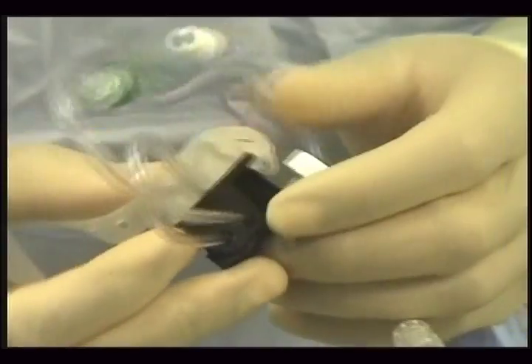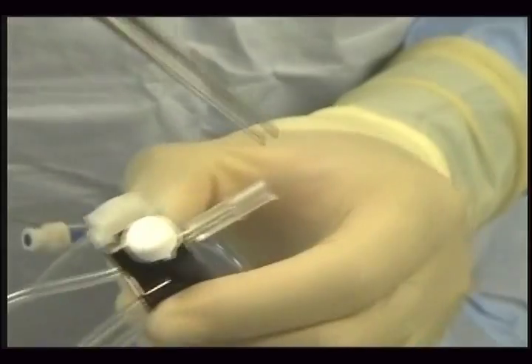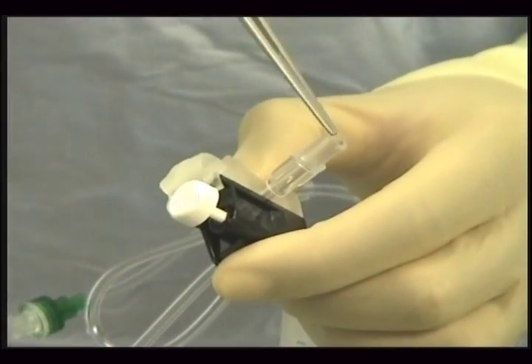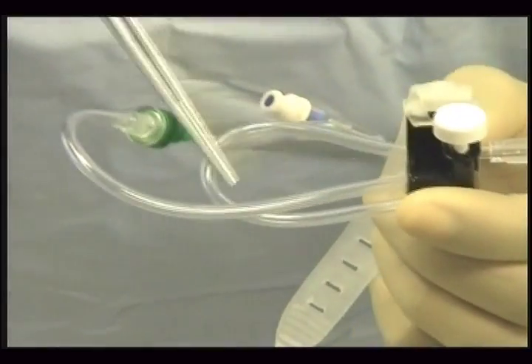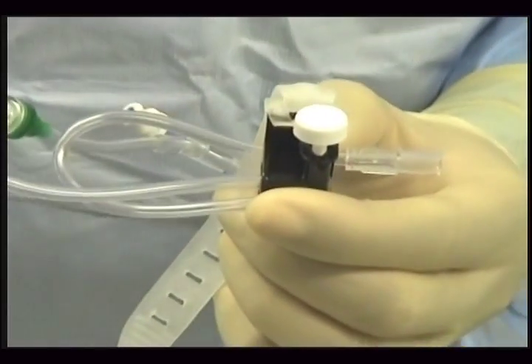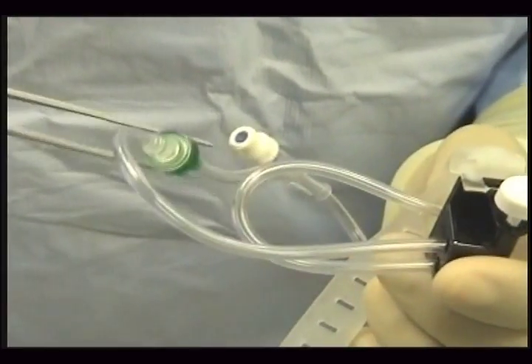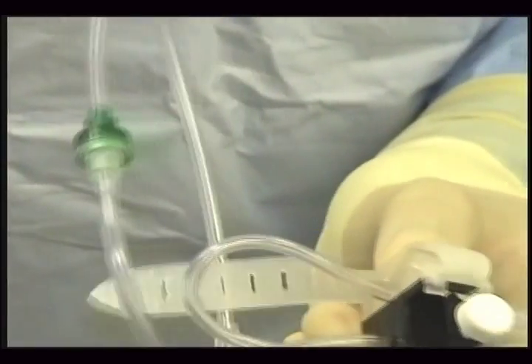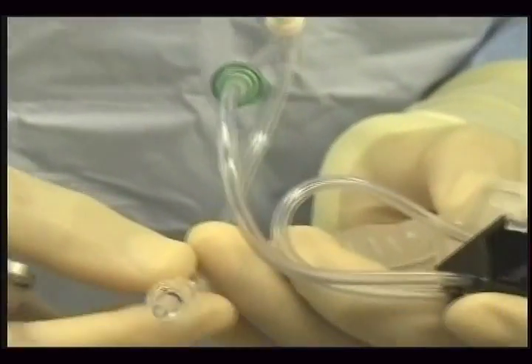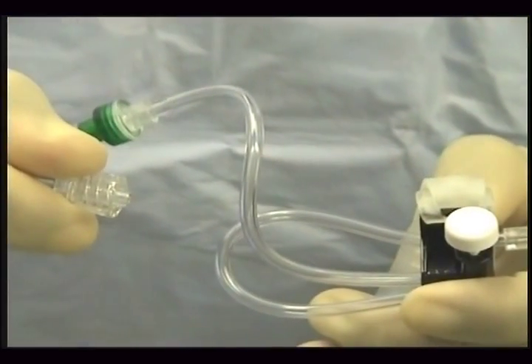The inlet port — the water goes in here through the irrigation bag, and this is designed to resist kinking of the tube. The outlet port comes out from here. This is a check valve and this is an injection port. The end of this goes into the urethroscope and this slips on to tighten it up in place.